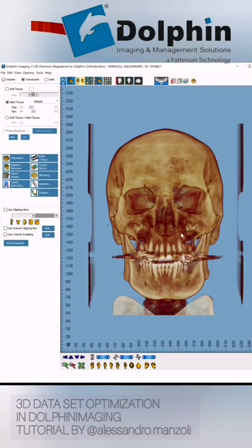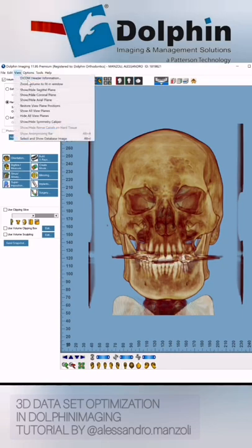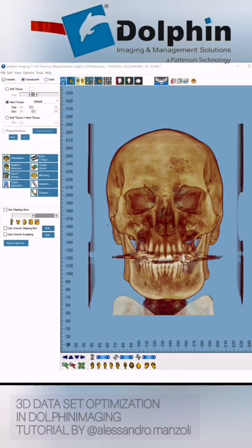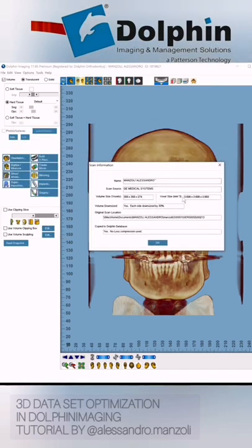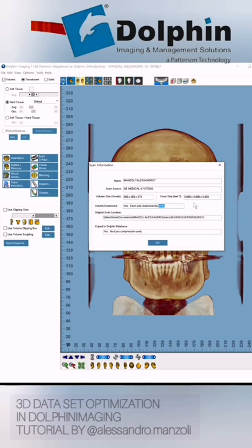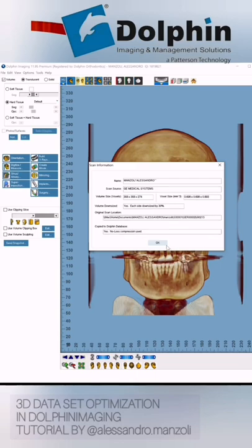So here we have the DICOM, and if we go to 'View DICOM Header Information', you can see the new values. The voxel size in this case is 0.698. This 30% downsize value is really recommended to make 3D planning possible without out-of-memory errors. This is the very first step. When you have a voxel size something larger than 0.4 or 0.5 — of course it also depends on the resolution and the number of slices — you should be okay. So downsize before importing the DICOM.